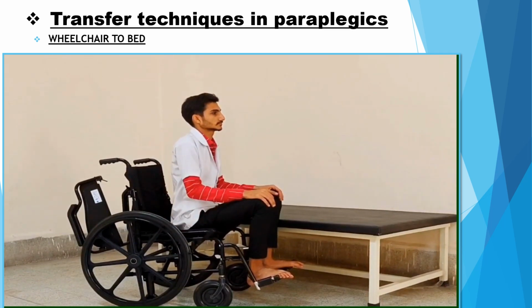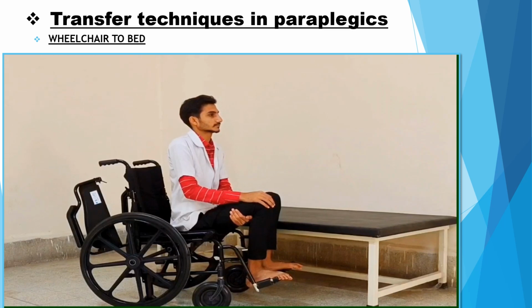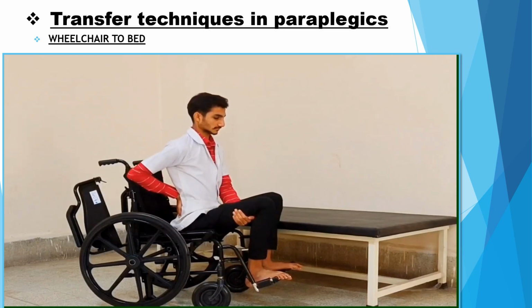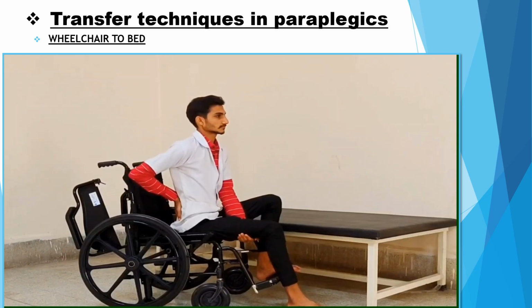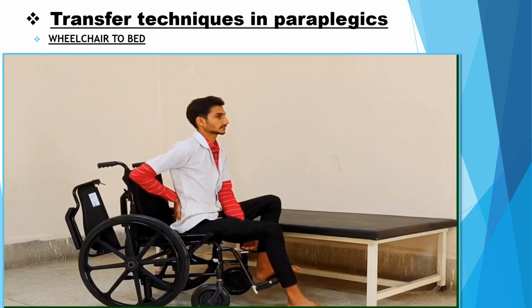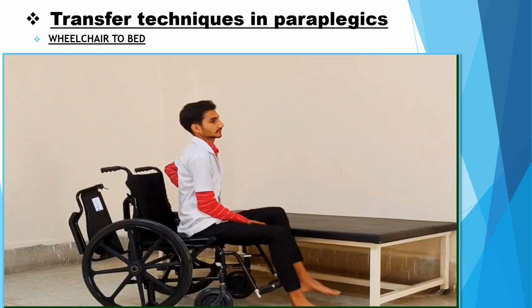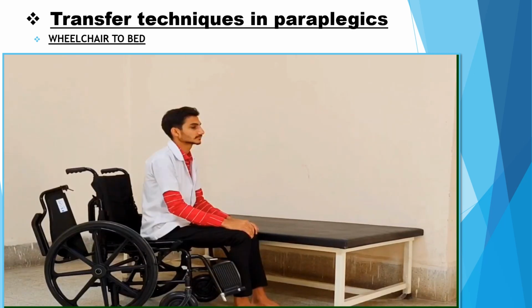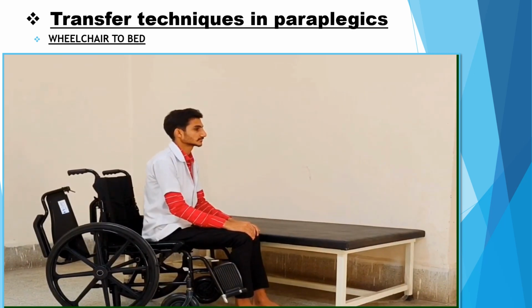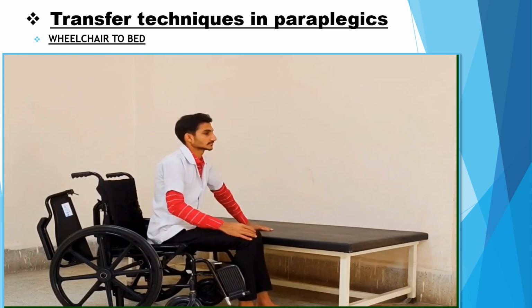Step 2. Positioning the feet onto the floor. The left arm lifts the right leg onto the ground and the right arm is used to hold the trunk upright. The mirror of this procedure is used to position the left leg onto the floor. Step 3. Positioning the hands. The right hand is placed onto the bed and the left hand on the front corner of the wheelchair.